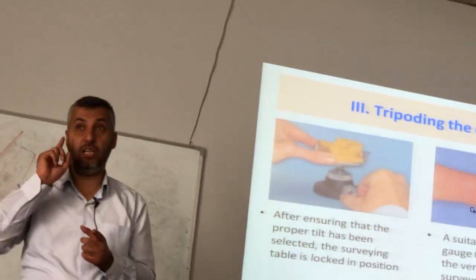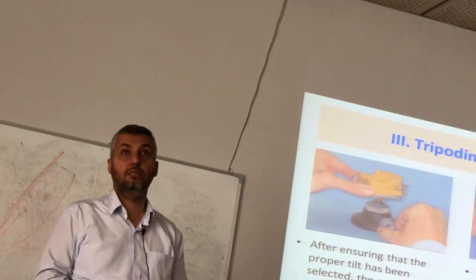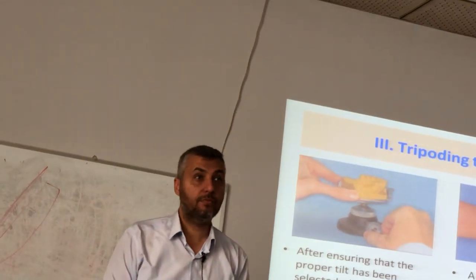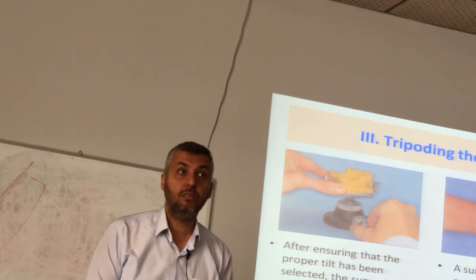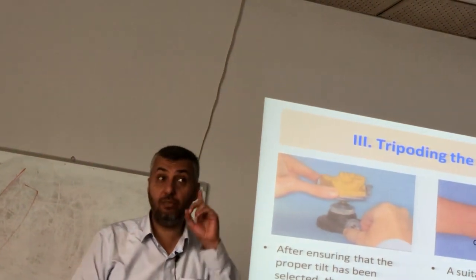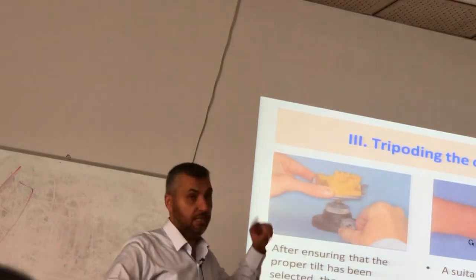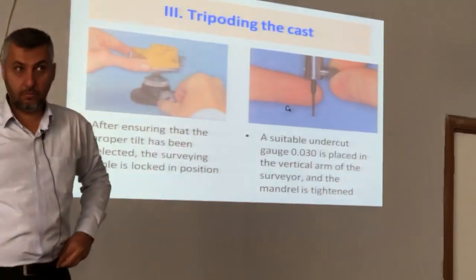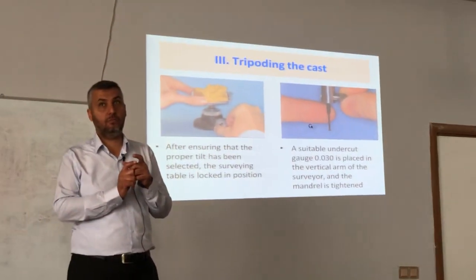Question: this helps us to get the most desirable tilt of the cast, right? No, I said after tilting. After getting the most desirable tilt, we do this. If one of the points doesn't touch, then it is not in the correct position.